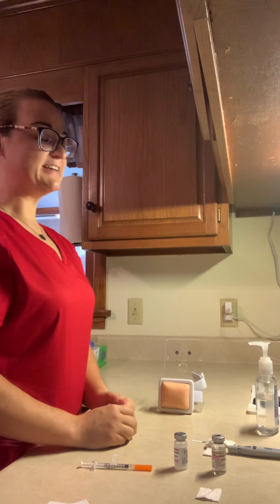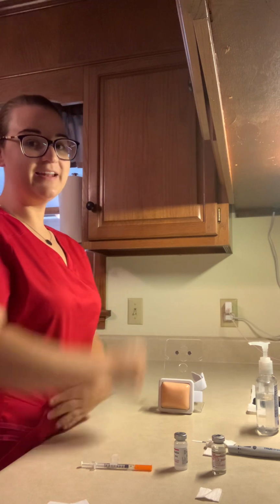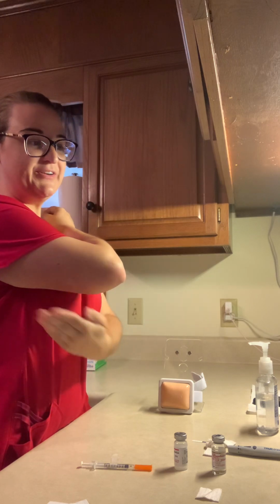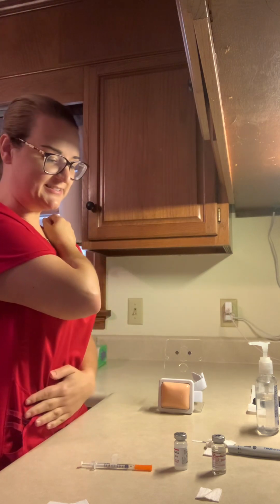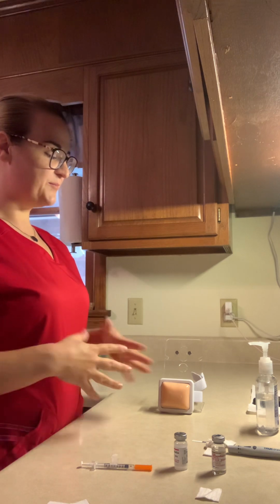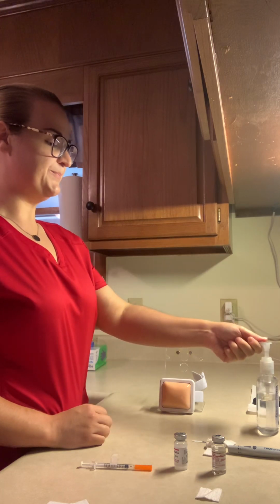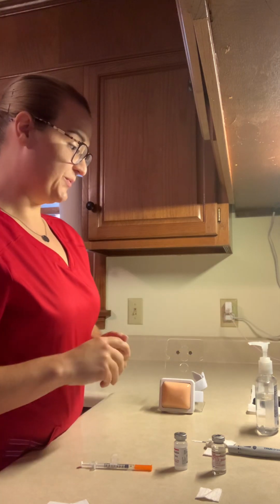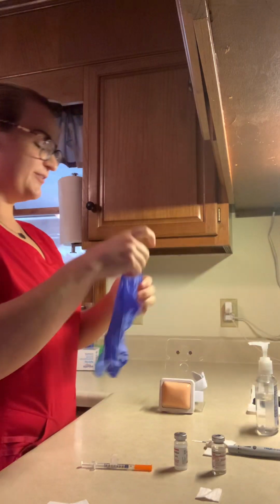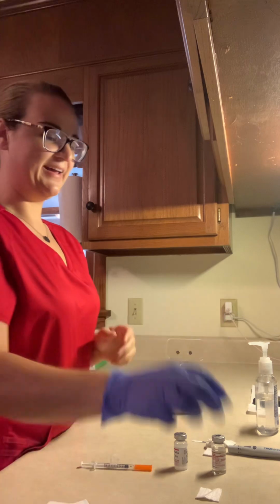Okay. Sites that we can administer insulin in are our abdomen, subcutaneous tissue in our arms, obviously subcutaneous tissue in our abdomens, and subcutaneous tissue in our thighs. I'm going to go for the abdomen today. So, Mr. Johnson, is this okay? Is this all right? Do you mind verifying your name and date of birth for me one more time? Great.